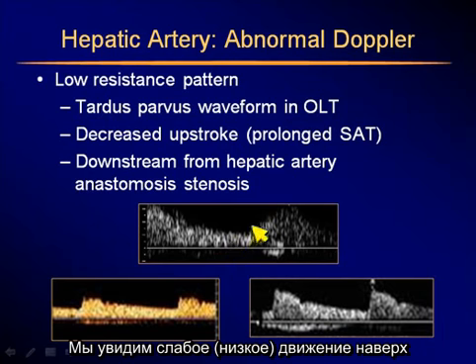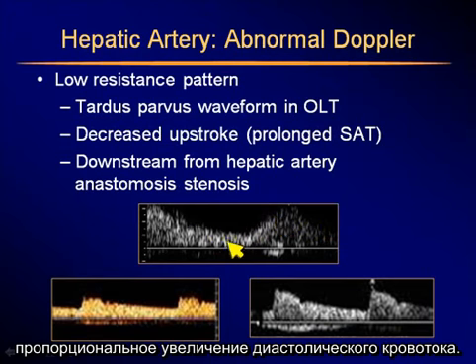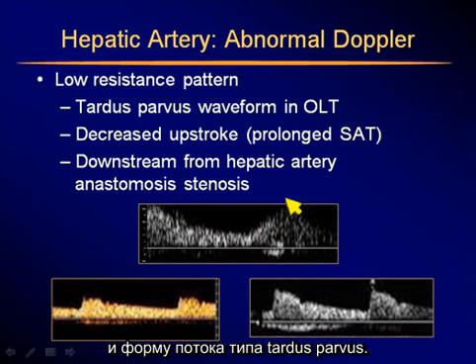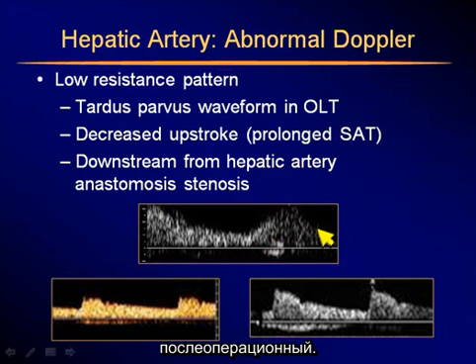We would see low upstroke and fairly low velocity, which means that proportionately the diastolic flow is elevated. So we have a prolonged systolic acceleration time, and then this tardus parvus waveform. What it means is that there is a hepatic artery stenosis, an anastomotic stenosis post-operatively.